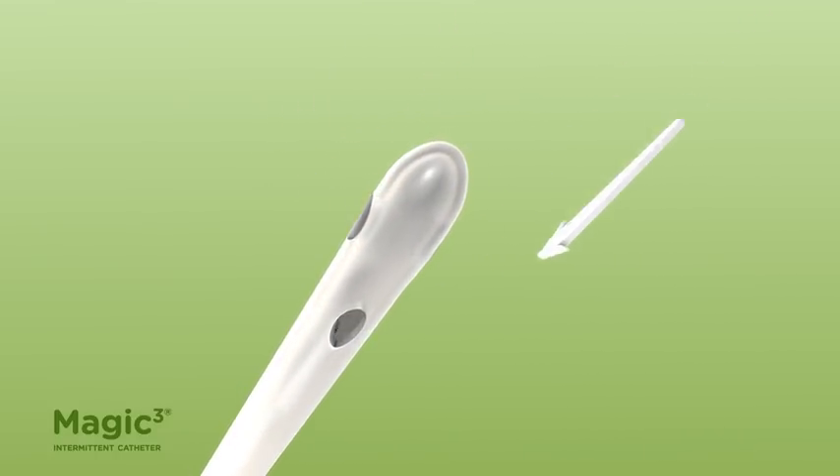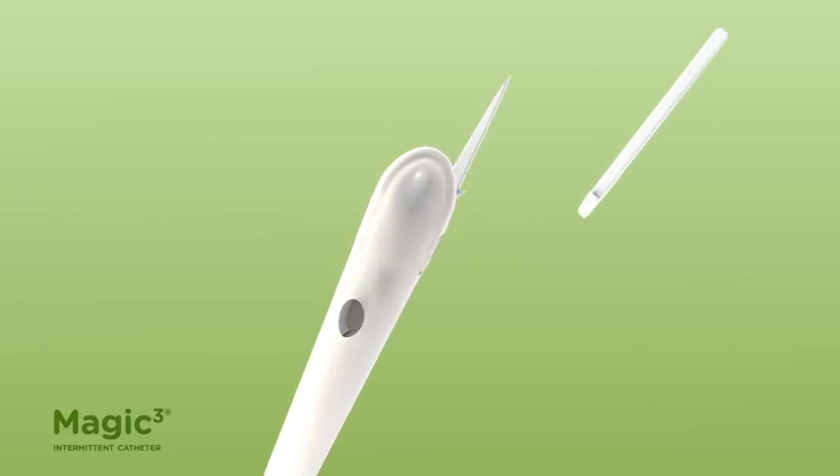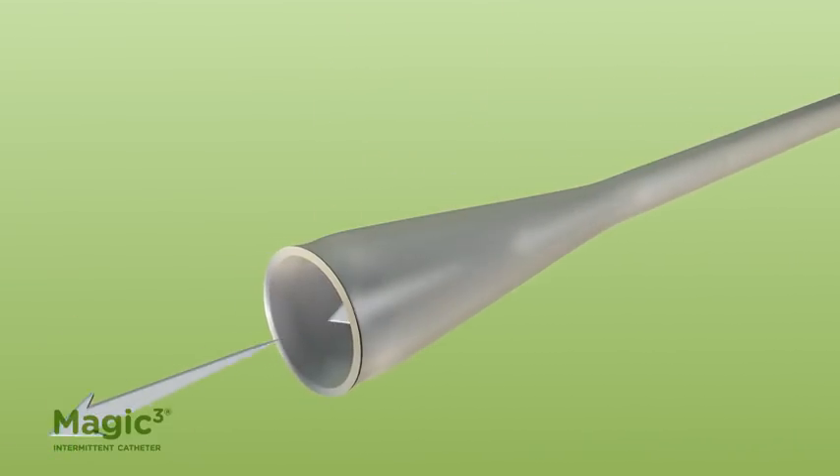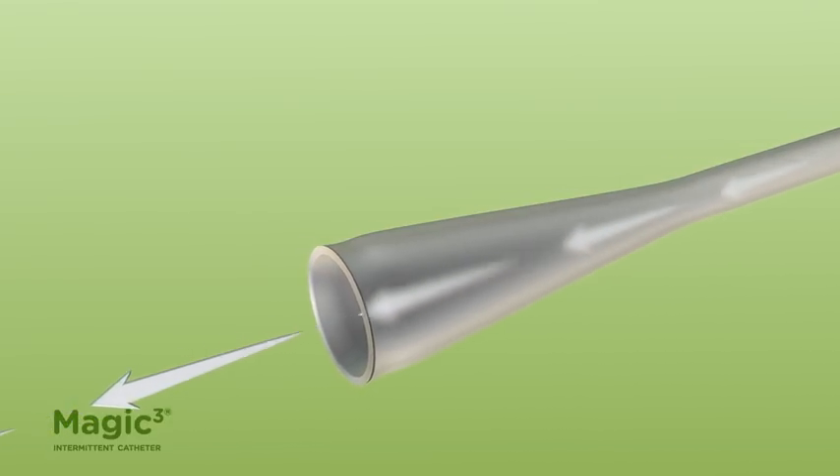Urine flows into the catheter tip through the four drainage eyes, and flows out of the catheter through the funnel-shaped outlet.